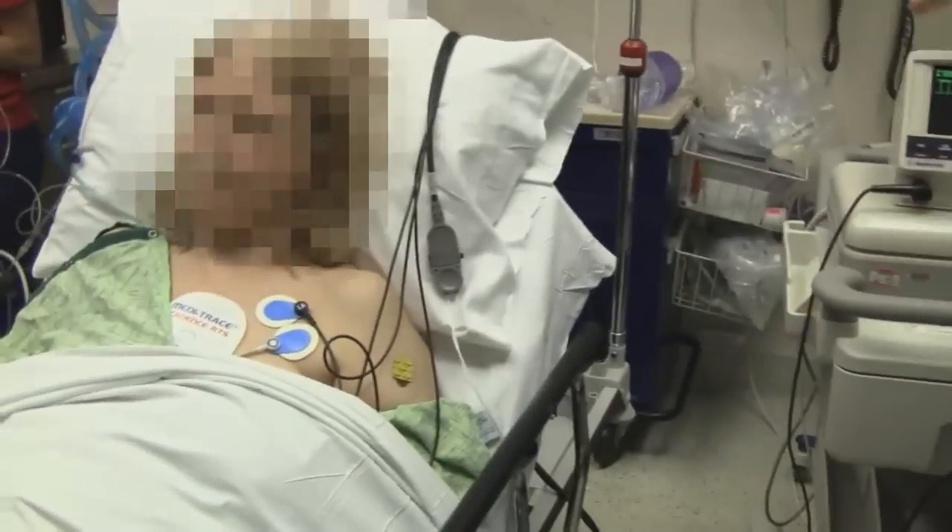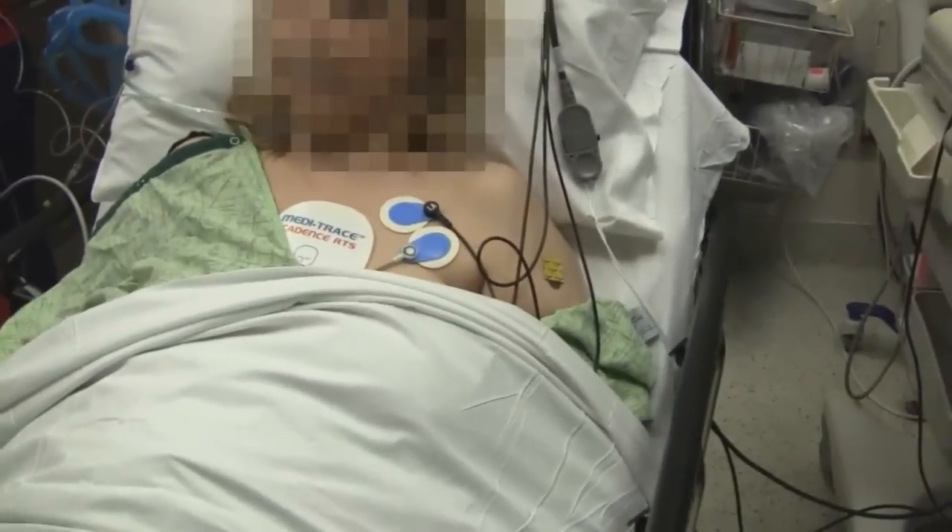We actually have the pads on your chest already. Do you mind being on camera? Yeah, I don't mind. What voltages are we going to use? I believe we'll do 50 joules. 50 joules? Okay, let's start with that.